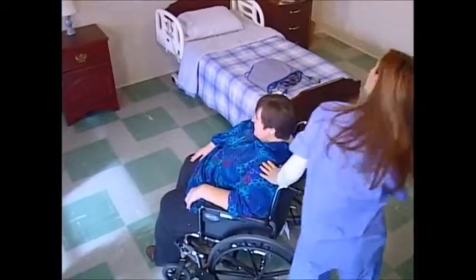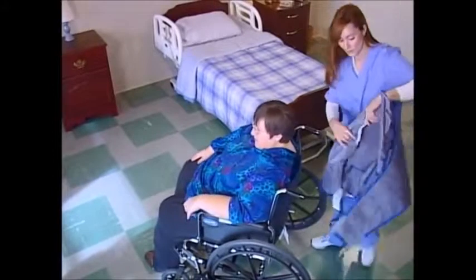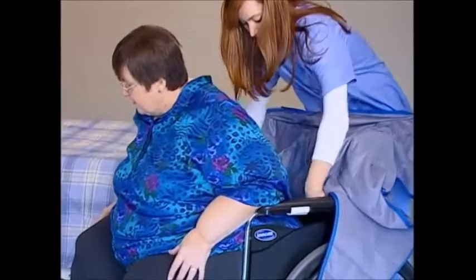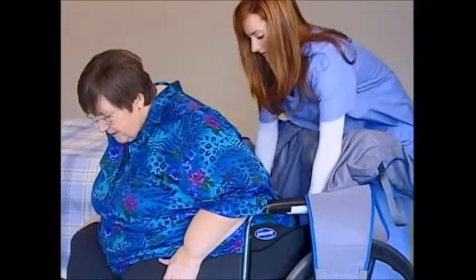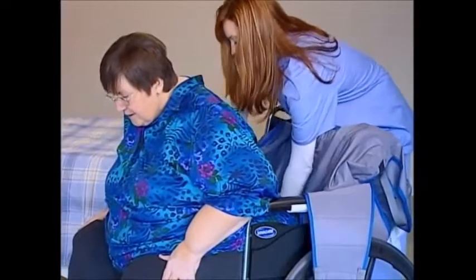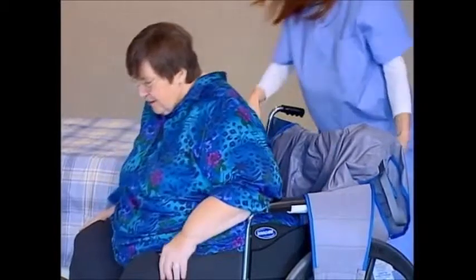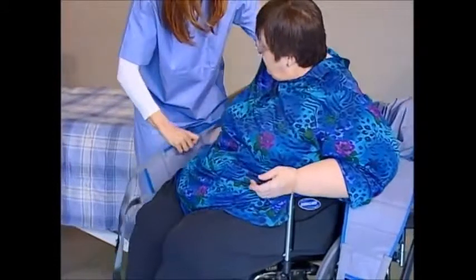Position the sling on the resident. Have the resident lean forward in the chair. Take the sling and slide it behind the resident with the smooth surface against the resident's body and the grab handles outside. The sling should be positioned between the top of the resident's head and the base of the spine. Make sure it's straight and parallel to the resident's shoulders.